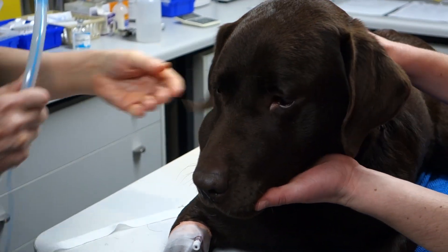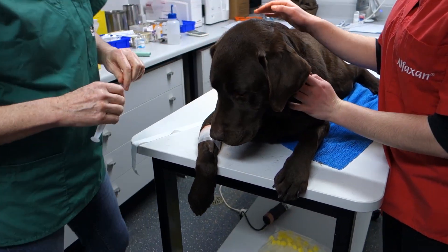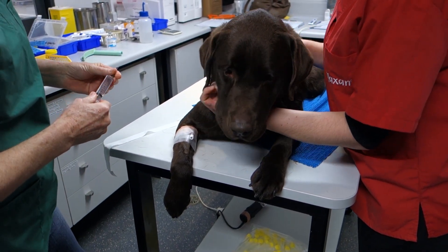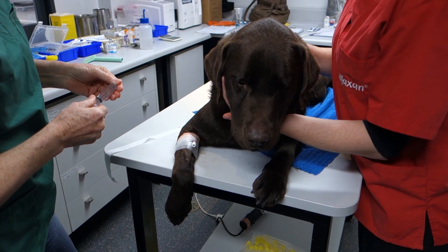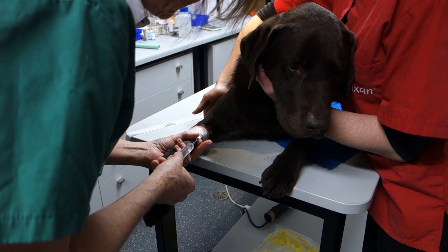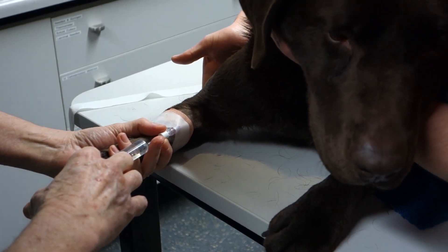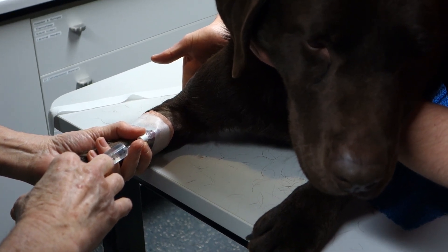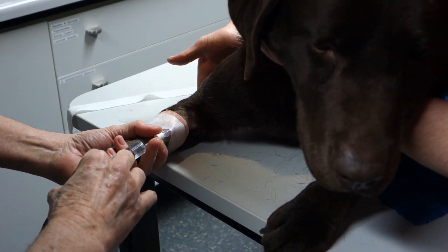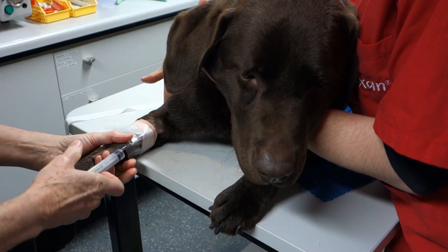Our vet nurse will be monitoring Richie. I've got my induction agent, Alfaxan, here. We already have him with an intravenous catheter in place, and I've calculated his total dose to be about nine mils. So, injecting it fairly rapidly — a big bolus. It'll go up his vein, through his heart, and then a good percentage of it will go into his brain.